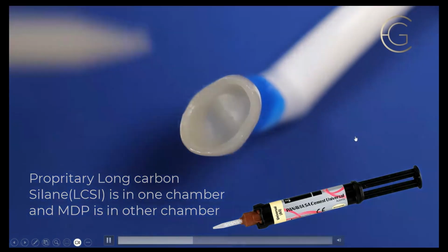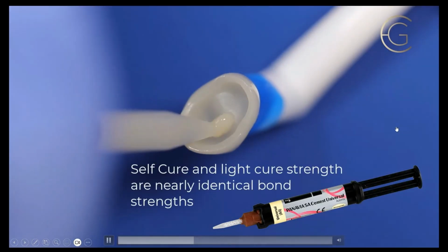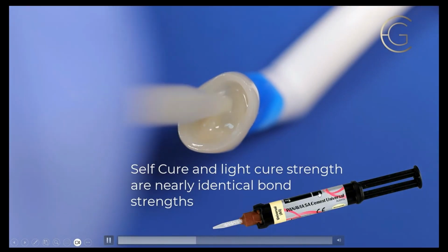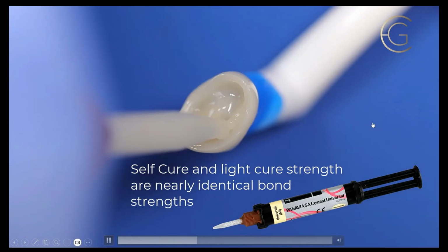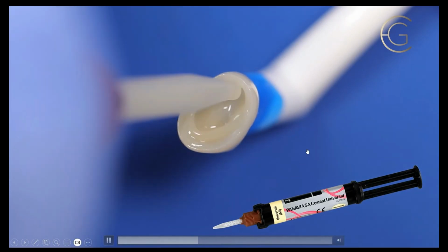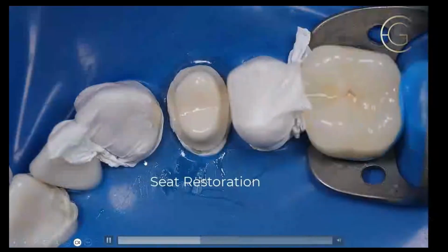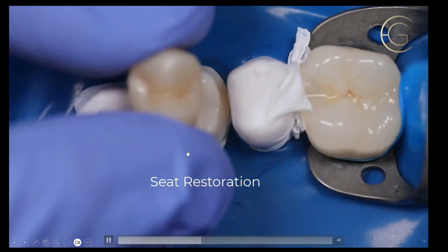One has MDP, which is the only thing that helps with the bonding of zirconia. The silane, the long carbon chain silane in the other tube, does nothing for zirconia, but it does something for your lithium disilicate. So this is a great universal cement for all the products you're using, okay, especially in the posterior. So I've got everything isolated.